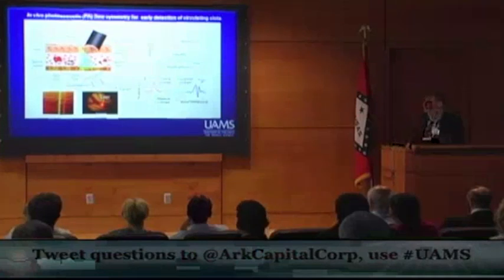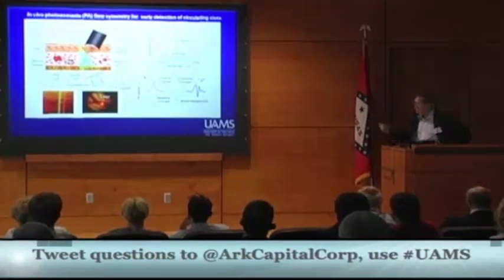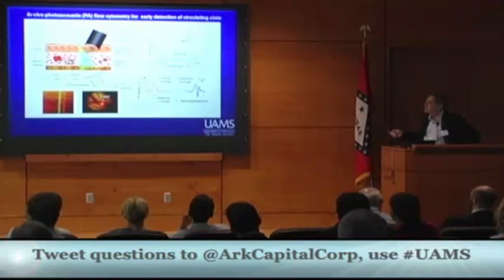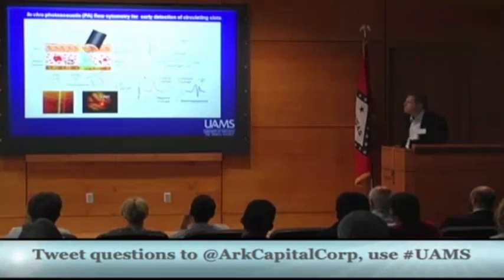But no technology how to do it, different technologies. And how it works? A laser radiate pointer or diode laser, which is used in CD players, very small, it's enough for this technology. Irradiate blood vessels, produce signals, transformation in heat and acoustic, which are detected with an acoustic transducer, some component of ultrasound technology.